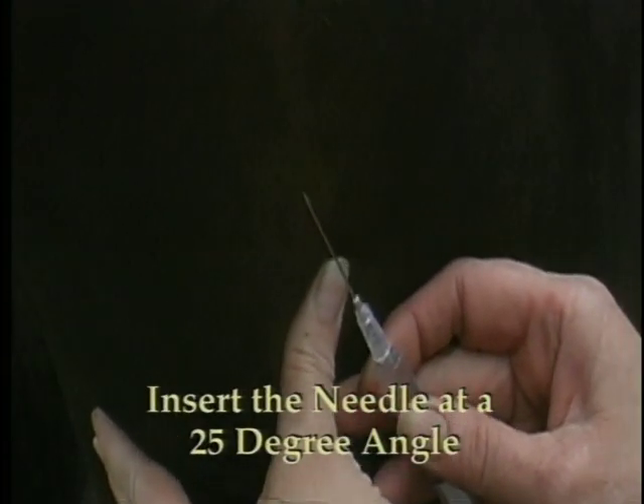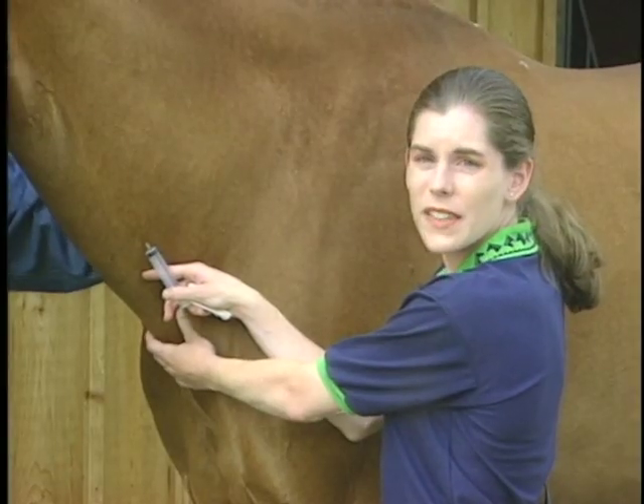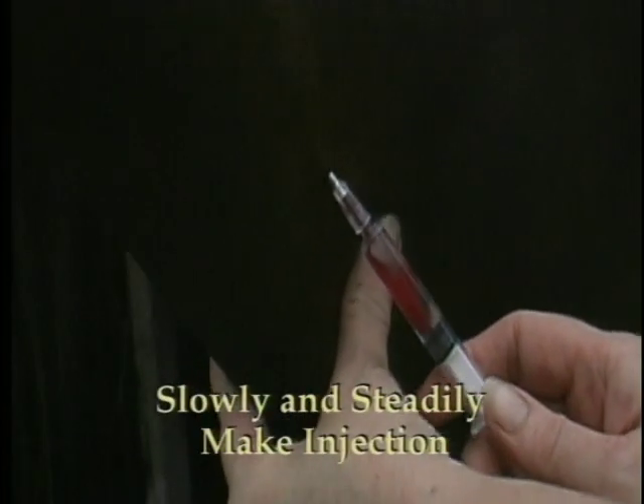Insert the needle attached to the syringe into the vein at approximately a 25-degree angle to the skin. Alternatively, you can insert the needle without the syringe into the vein at the same angle. Confirm that you're in the vein and not the artery, then attach the syringe. Draw back on the syringe to make certain it fills easily with blood, and then slowly but steadily make the injection.